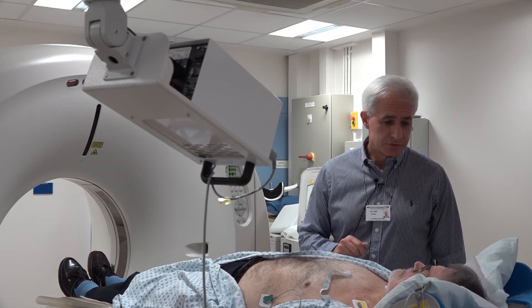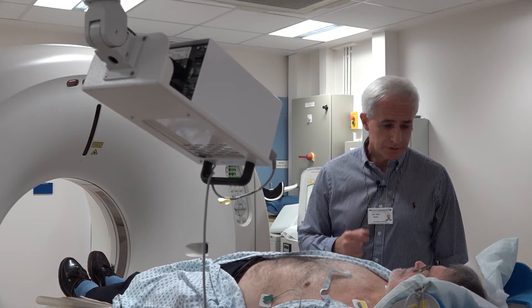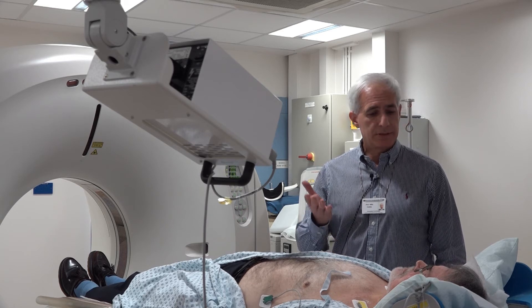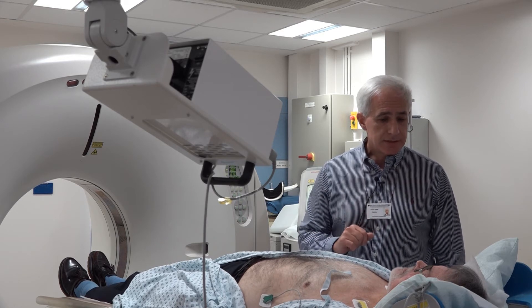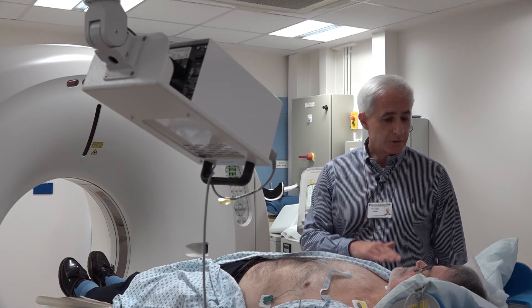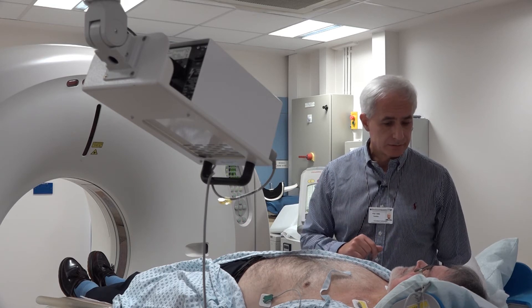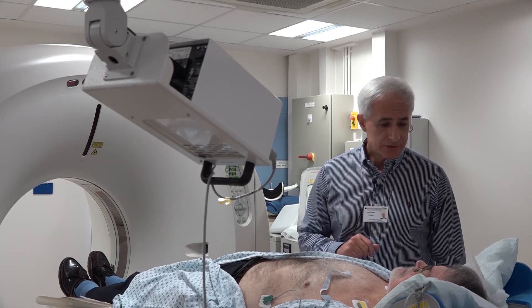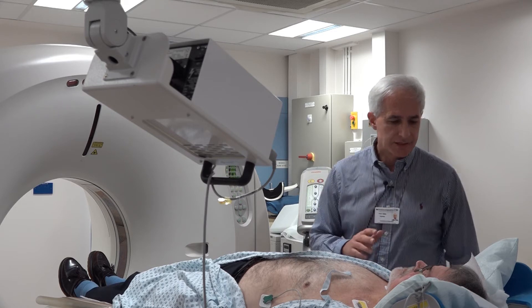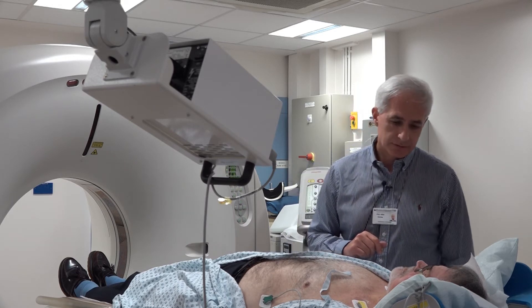Apart from relaxation, we also ask you to follow breathing instructions. At the intervals, we are going to ask you to take a breath in — a nice and easy breath into your chest. Not a huge breath, just between your normal and the maximum breath hold, and hold it there until we tell you to breathe away. That won't be much longer than 10 to 12 seconds of breath hold.